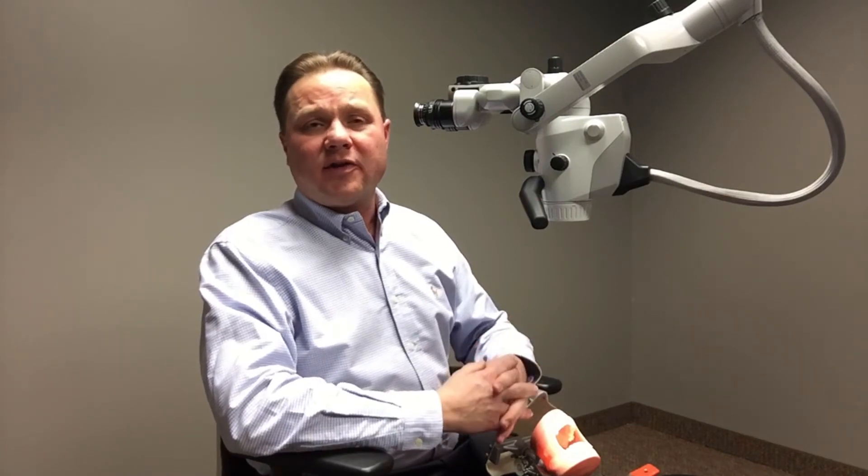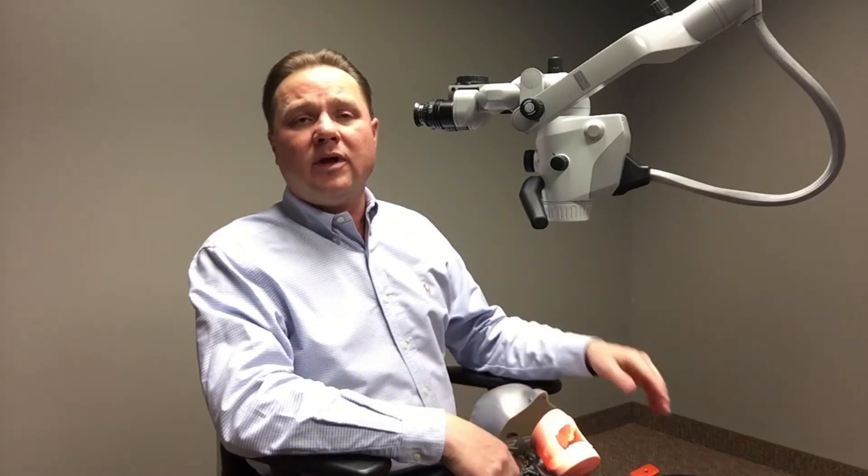The nice thing is that with Xtero, we have a couple of different options — Mora and our foldable tube — that can be built into the microscope.